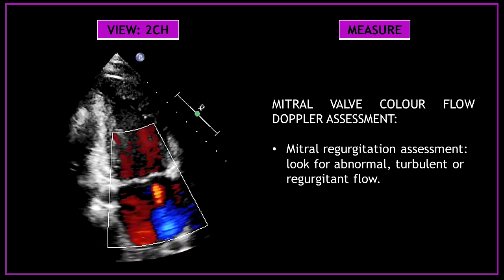Now use color Doppler to assess the flow across the mitral valve. As part of the mitral regurgitation assessment, look for abnormal, turbulent, or regurgitant flow with color Doppler.